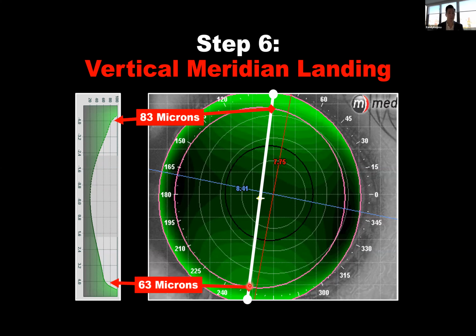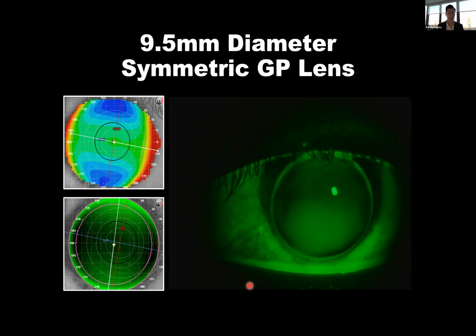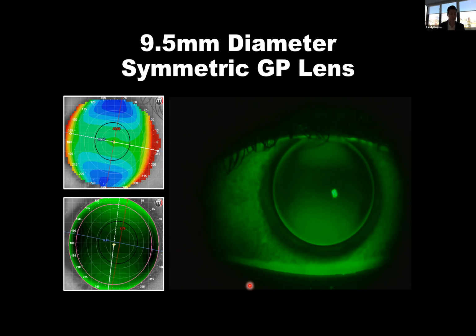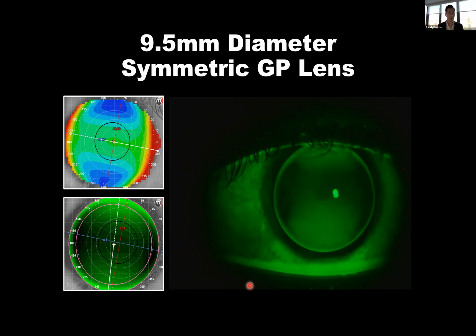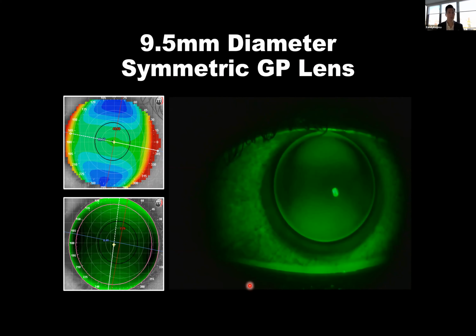And of course, to be able to resolve how much fluid is underneath the lens along the steep axis, we really need a toric. And you can see that in this lens. Here's your symmetric lens placed on this eye. It has good alignment across the horizontal because the lens is touching down. You can see laterally, it's very stable. But vertically with each blink, we can see a lot of lens movement. We can see some tilting of the lens. We really could have a better relationship.